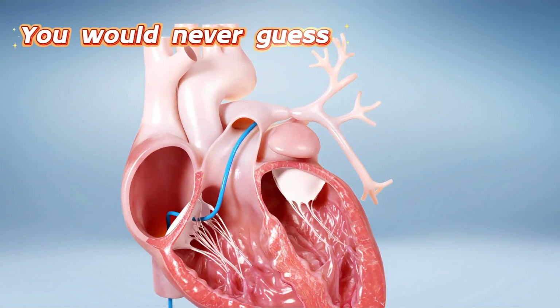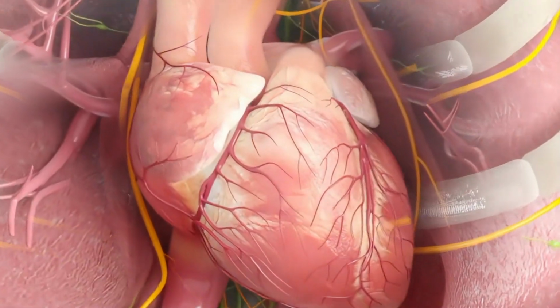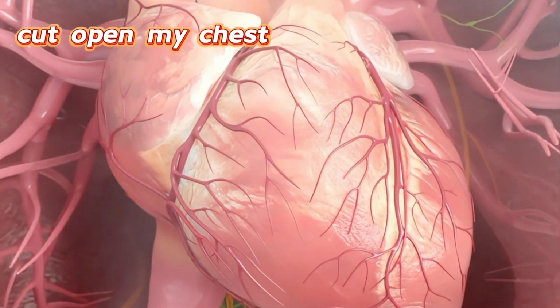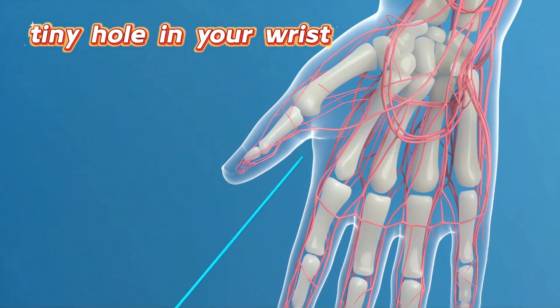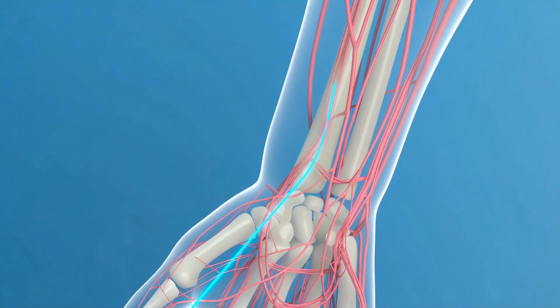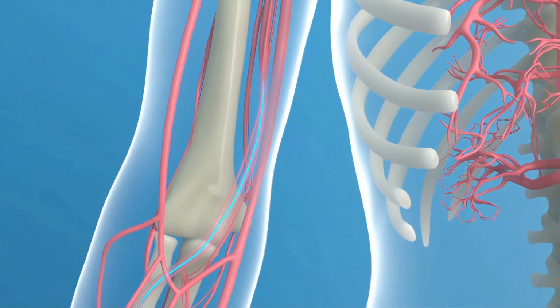You would never guess where a heart stent enters your body. I used to think, no way, they have to cut open my chest, right? The truth is, the doctor makes a tiny hole in your wrist. A catheter, even thinner than your blood vessel, quietly starts its journey from there.